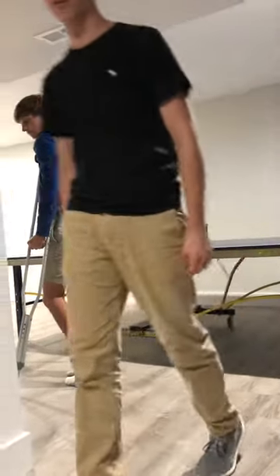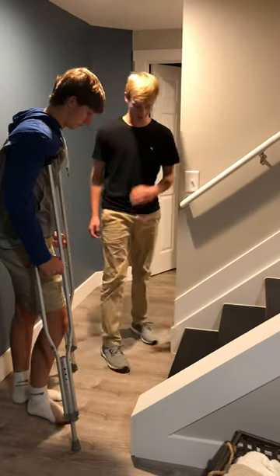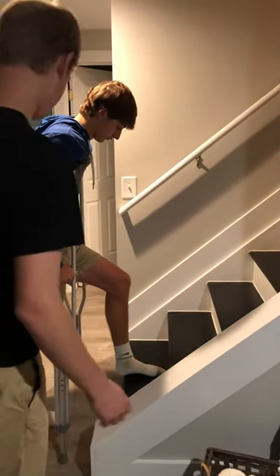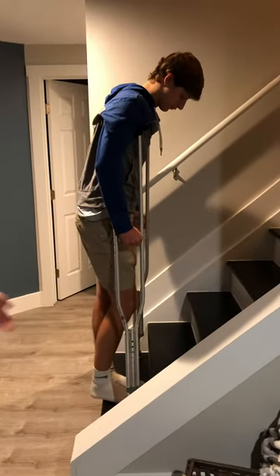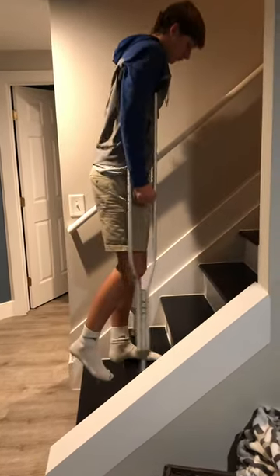Alright, now I'm gonna show you how to go upstairs. So what you're gonna do is step with your good foot first, and then push yourself off the crutches. And then make sure to crutch up after you step. That's it.